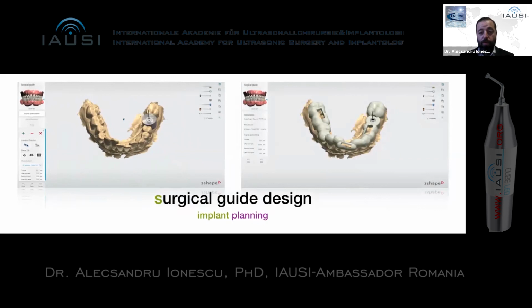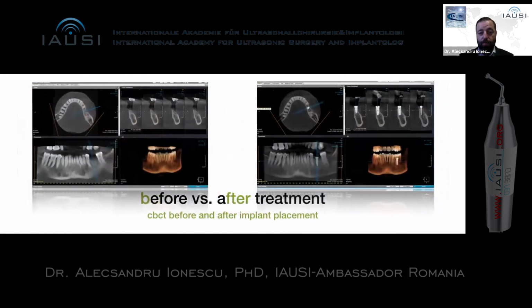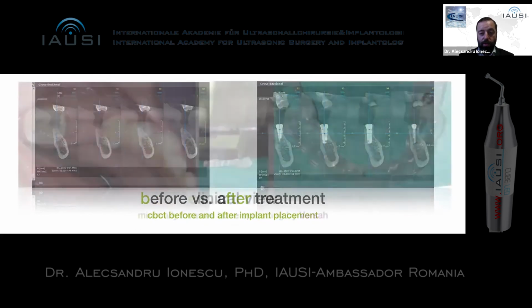But it's very important to have the right position of the implant, regardless of the bone. We need to do it connected to the concept of the future prosthetic. And this is the before picture and after the bone spreading that we did here. And you can see if we had a nice open healing concept in this case, we would have a much nicer and larger ridge.